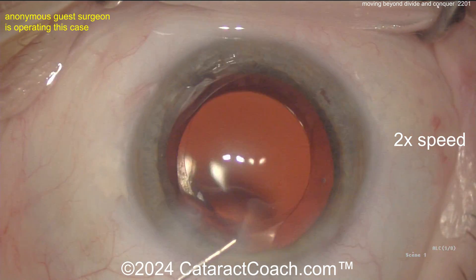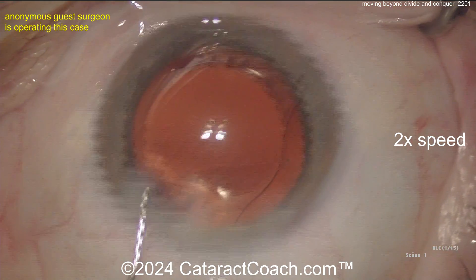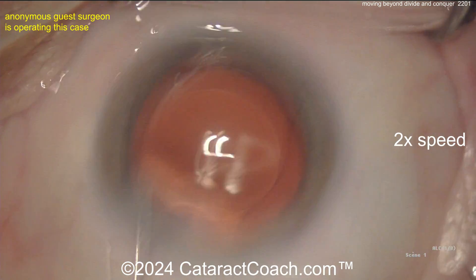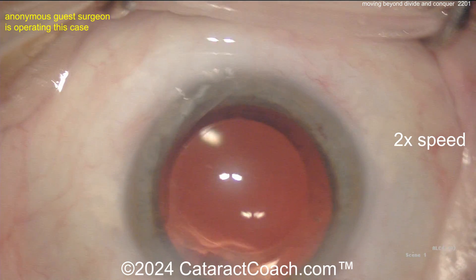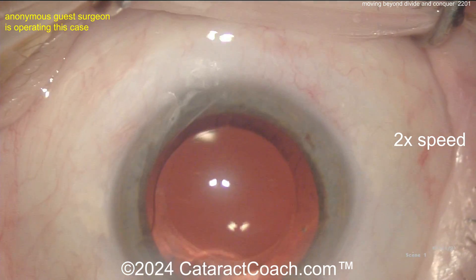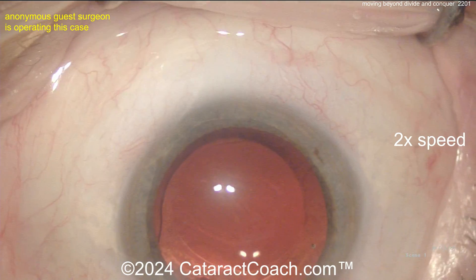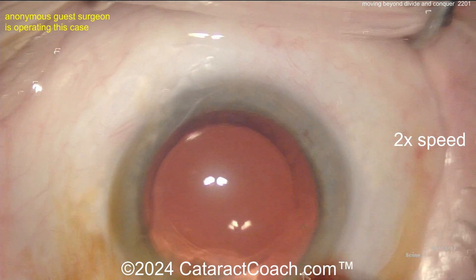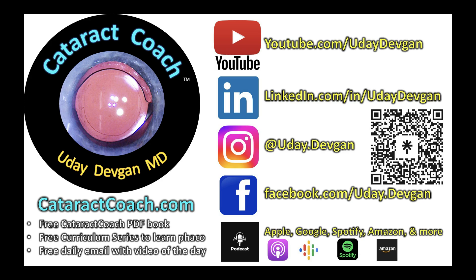I think that's just the incision — I don't think there's any cortex left. Good job with your case; I'm proud of you for trying. It was not a good stop and chop case, I'm sorry to be honest, but you definitely need to improve those skills. Try to get a better groove so you can have full separation of the pieces right off the bat — divide it into two hemi-nuclear pieces and chop each piece. There's a video on cataractcoach.com showing how to use the chopper to hold one piece away to make more room and pull the other hemi-nucleus out of the bag. Go to that teaching website, download the free PDF book, put it in your phone, study this every day, and become a better surgeon.